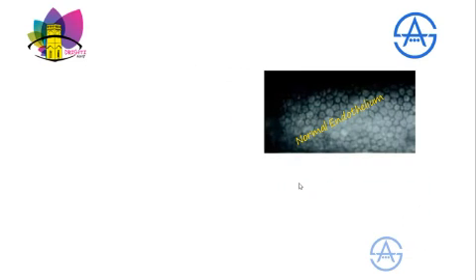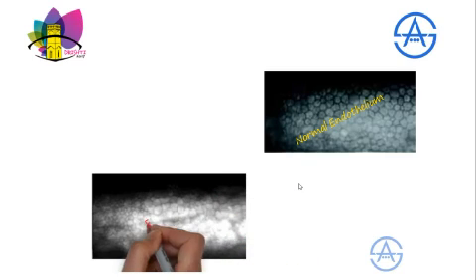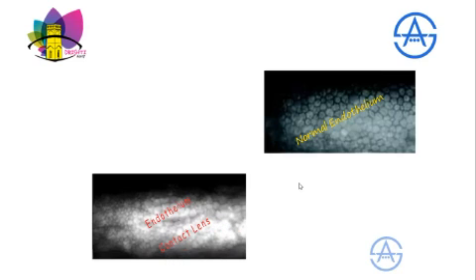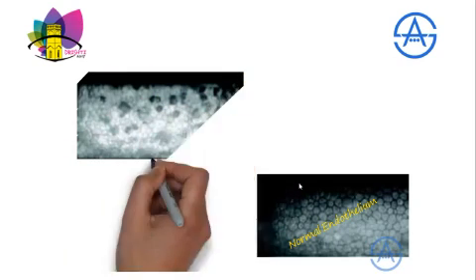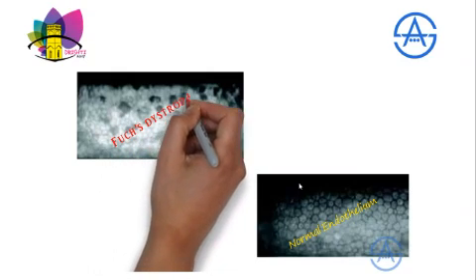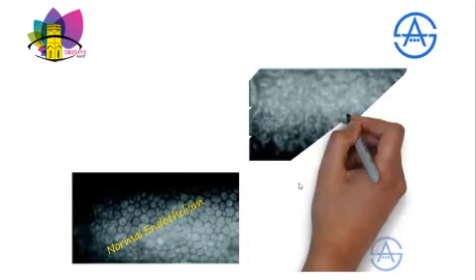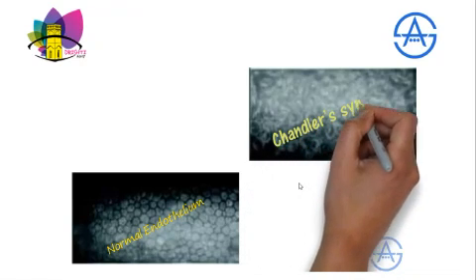Now this is how an endothelium would appear in a contact lens endotheliopathy, in which certain areas have stressed endothelium and the others won't have so. The normal endothelial cell count usually. Now this is a printout with a lot of guttae in the specular microscopic view that tells us this is none other than Fuchs endothelial dystrophy, which are excrescences produced. And finally, this is our Chandler syndrome, in which there is a total mishap of the hexagonal appearance of the corneal endothelium.